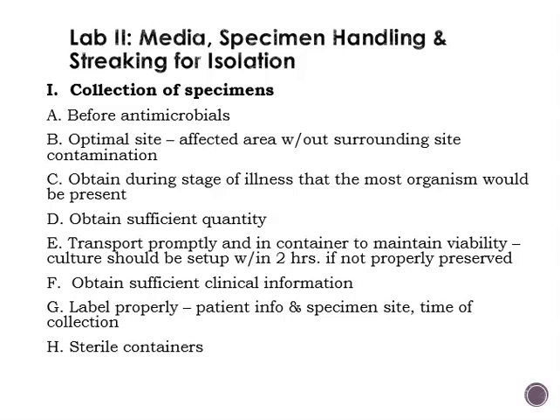We want to collect it from the optimal site, so from the infected site. We want to get the affected site without the surrounding contamination. So if say it's an open wound on a patient's leg, we want to put the swab in the wound, in the center of the wound, and avoid the skin area around the wound.